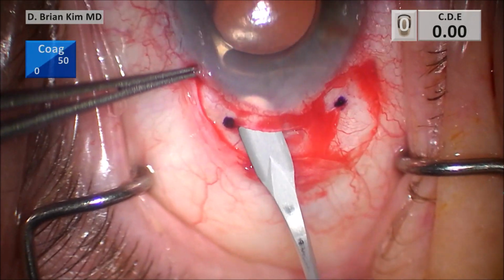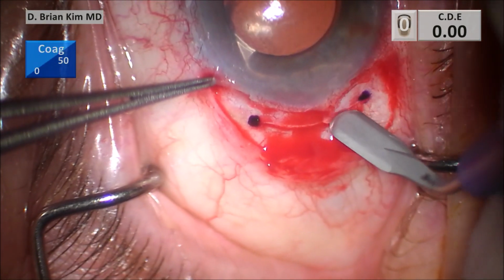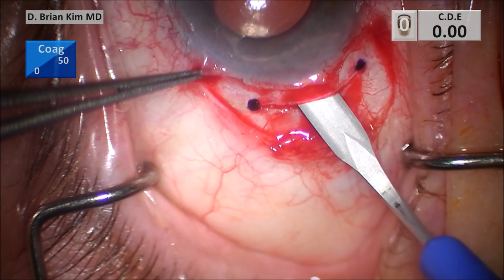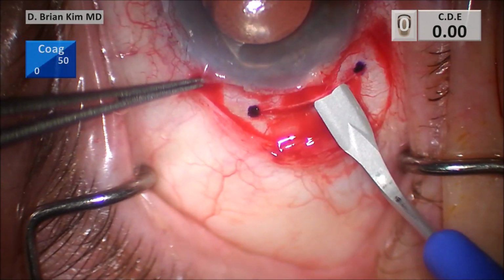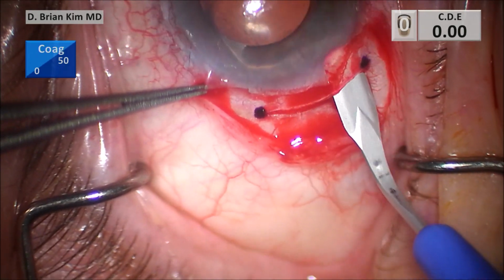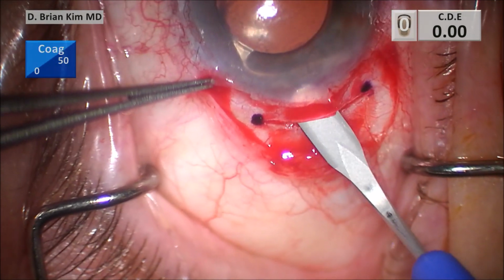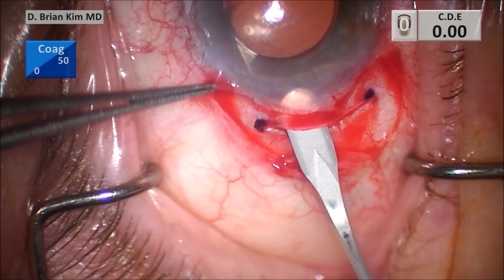And you want to make sure your forces are parallel and within the incision. You want to make sure you're parallel to those lamellar fibers on the sclera. If you lift while you're doing it, you might actually make the scleral shelf too shallow. You don't want to dive down because then you might perforate into the anterior chamber. And so that looks pretty good.